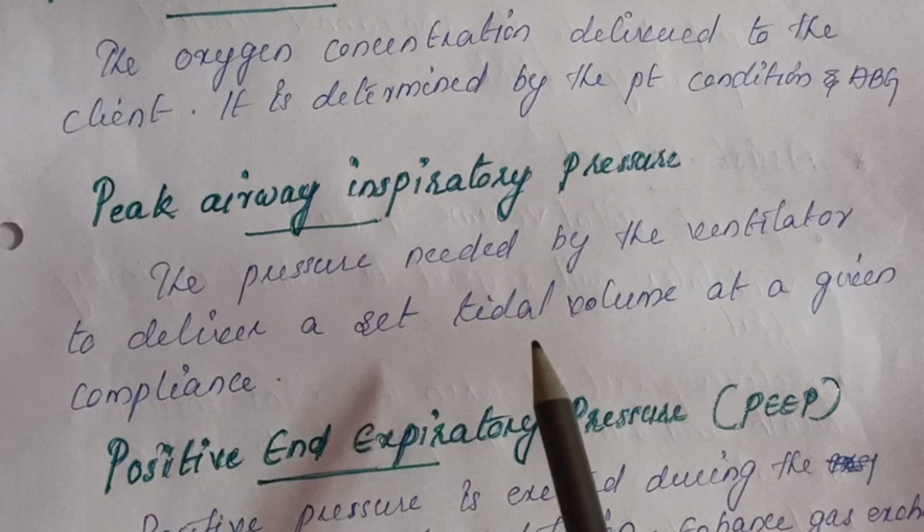The last one is positive end expiratory pressure, or PEEP. This is nothing but the positive pressure exerted during the expiratory phase of ventilation. This is a certain amount of pressure which will remain in the alveoli after the expiration. So this will enhance the gas exchange and prevent atelectasis. Atelectasis is nothing but the collapse of the alveoli. Some pressure will remain in the alveoli and the alveoli will not collapse. So this is called positive end expiratory pressure.